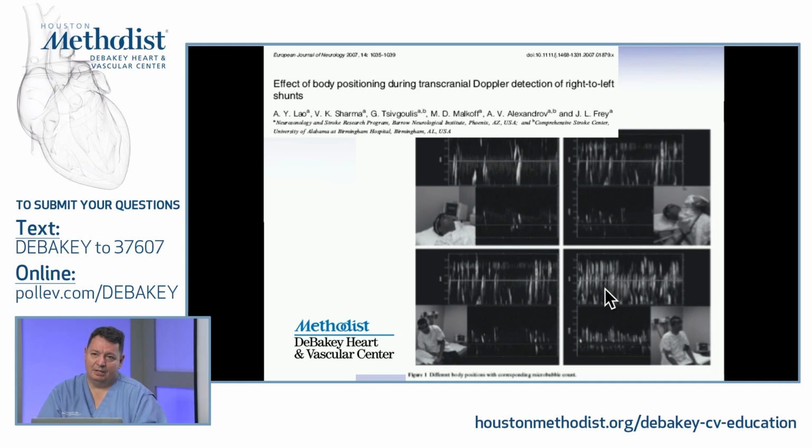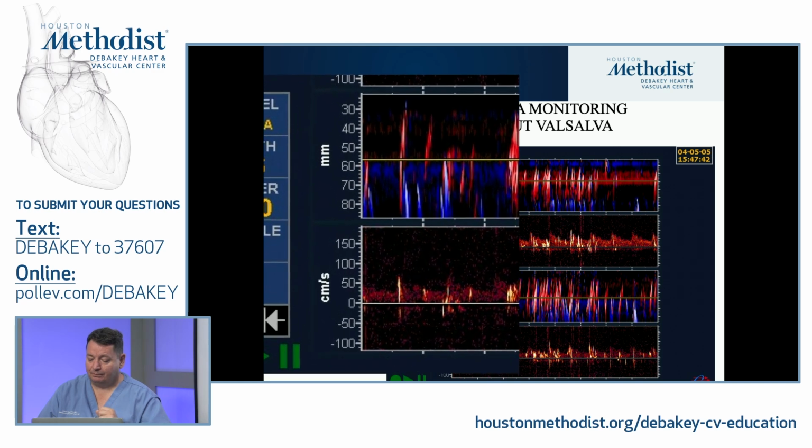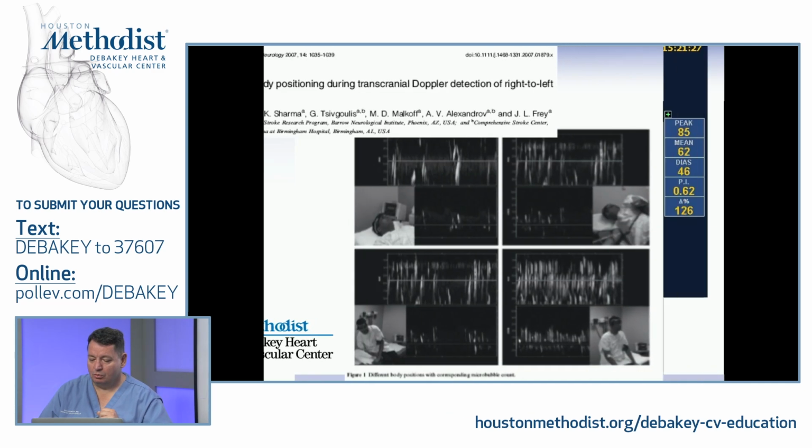Please take a deep breath in, hold it, bear down, think that you're constipated for a month and ready to go to the bathroom and delivering twins at the same time, and you're pushing a huge wine cask with your belly. These three motions, without any exaggeration, will produce a nice big purple-red head. Hopefully the eyes are not bulging out too much, and this is where you need to see the Valsalva effect show up on my TCD. And this is how it's going to show.